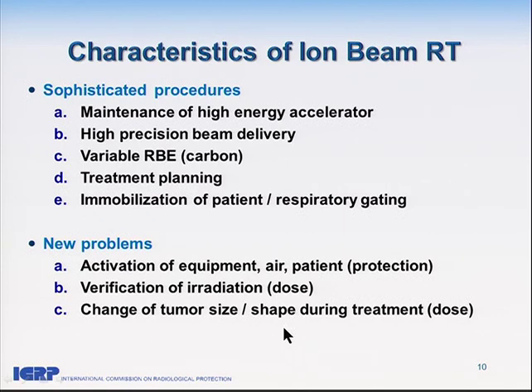And during the treatment, the tumor size may change. This will cause another problem. At this moment, we don't have any good solution, but probably we need a second or third treatment planning, even during the process, if the treatment continues 2 or 3 weeks.